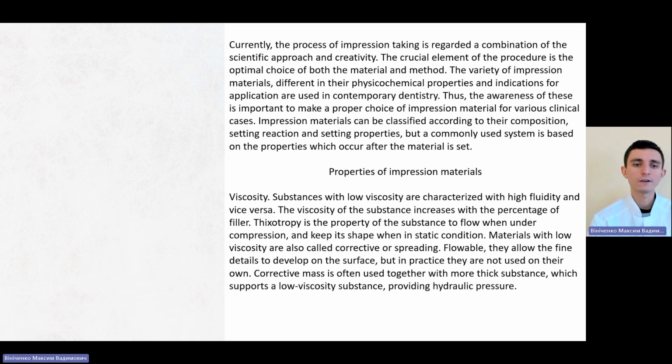Impression materials can be classified according to their composition, setting reaction, and setting properties, but a commonly used system is based on the properties which occur after the material is set.